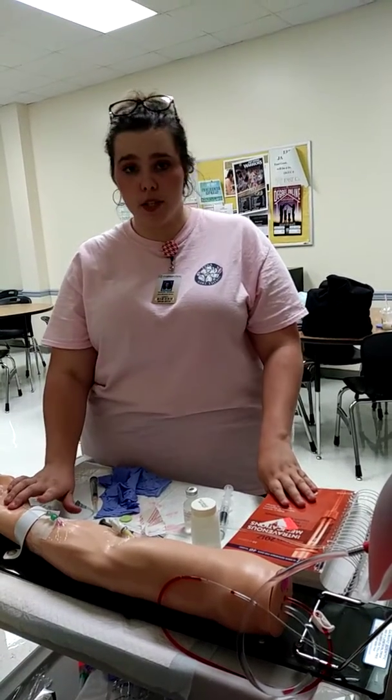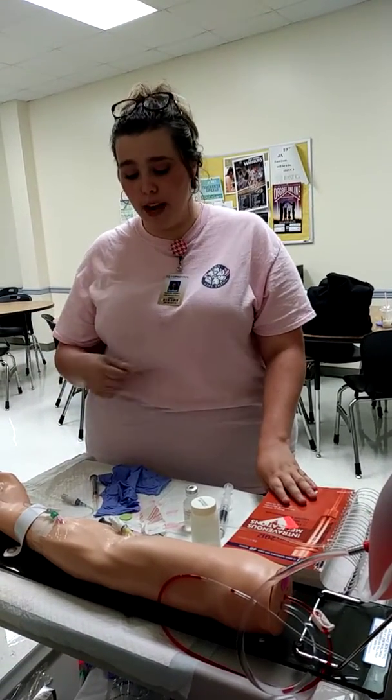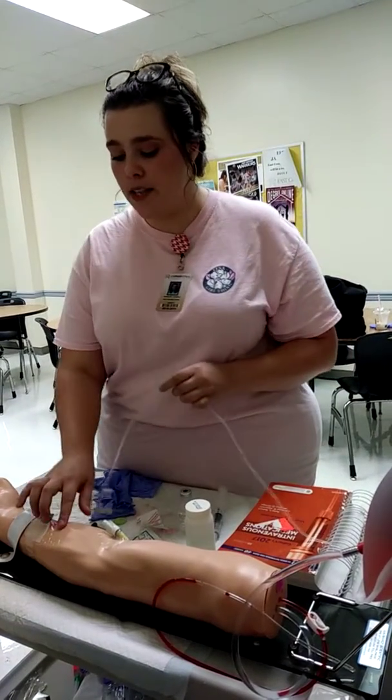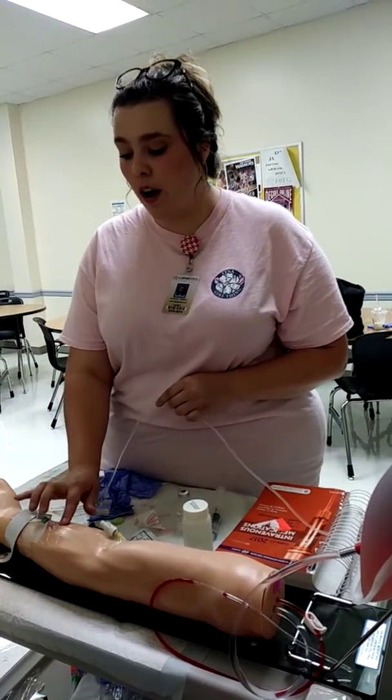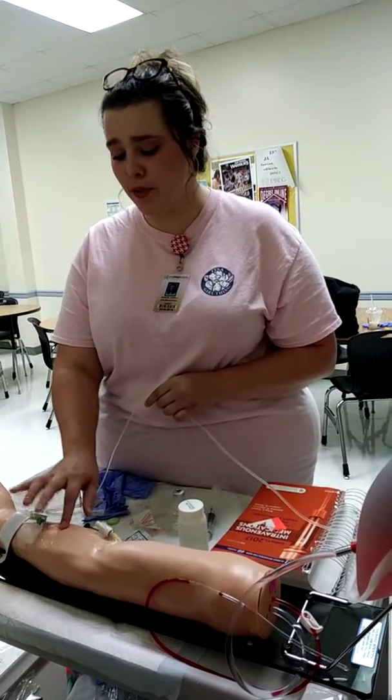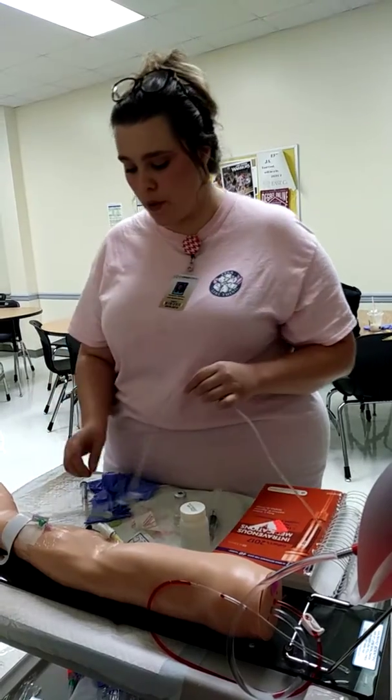I'm going to explain the procedure to the patient. I'm going to be giving him an IV push medication that is physician ordered. I'm going to check the IV line and make sure it's patent. I see no signs of infiltration. I ask him if he's having any pain. He says no, it feels good. I said, okay, we're good to go.